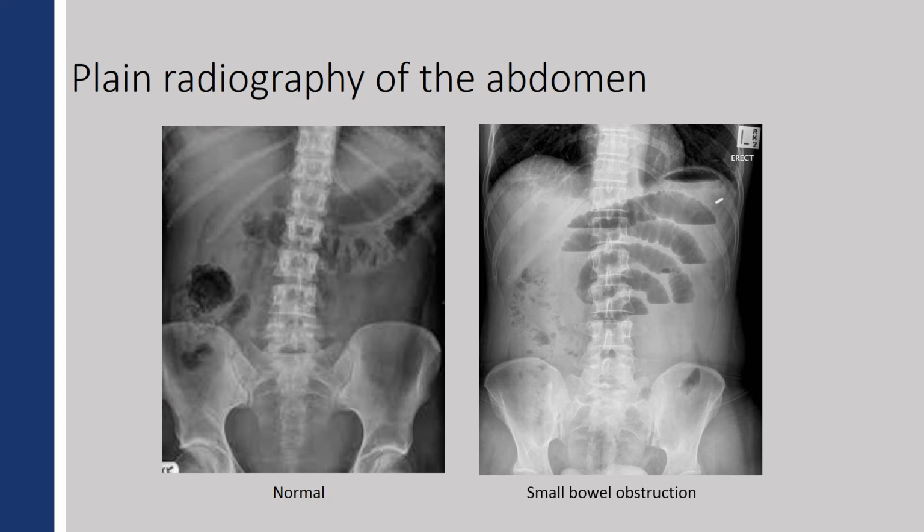What it's not good for is looking at things within the bowel, things extending from the bowel. We can see that there's a bowel obstruction, but we can't see what's causing the bowel obstruction. So plain radiography is quite limited in evaluation of the bowel.